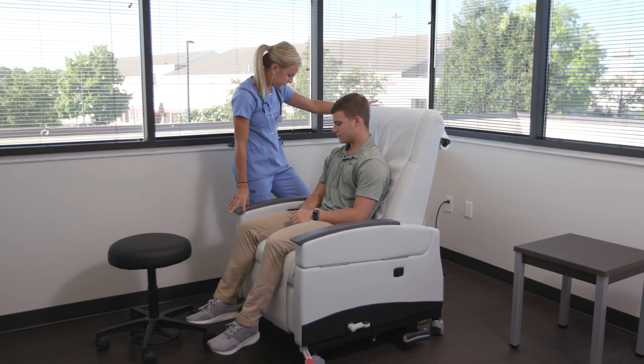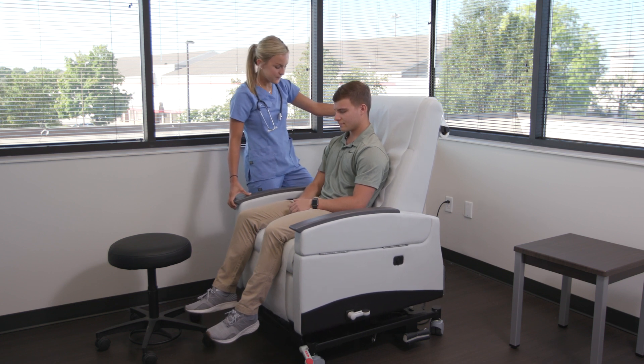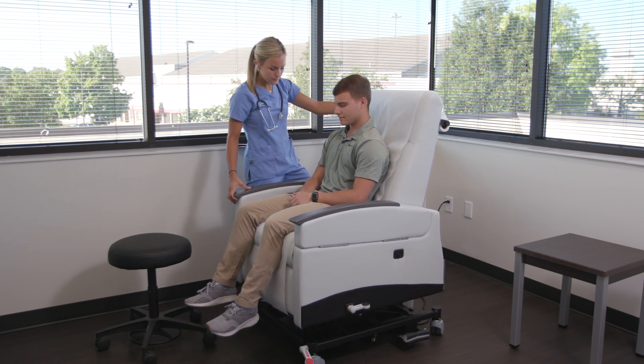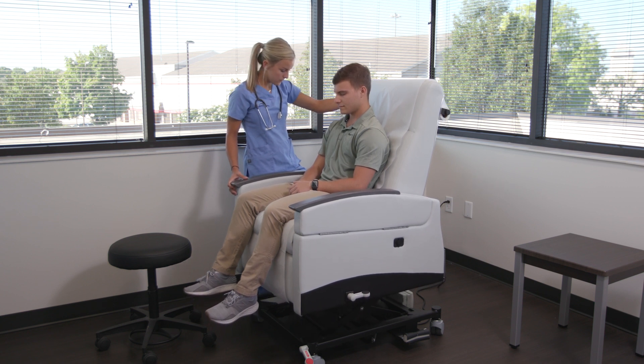Users are able to sit down as easily as they would in a normal recliner. When ready for an examination or procedure, the caregiver lifts the patient to the required height, ending the need to climb up onto an exam table, which may be difficult for some individuals.